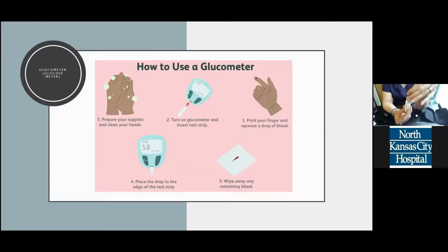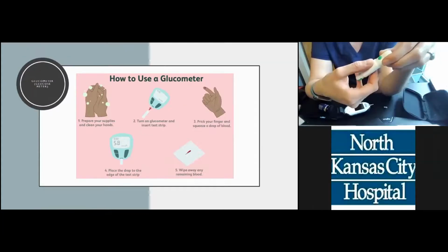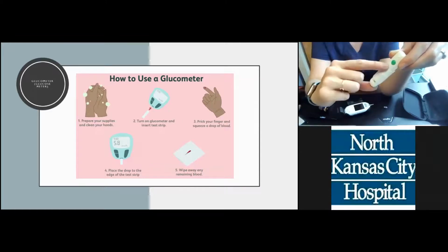So I put it in here and I'm going to twist the top just so it breaks that plastic a little loose, and then I'm going to pull it off. And I don't know if you can see this. There's a tiny little needle right there. Then I'm going to put the cap back on. And all of these have a spring, and you need to cock that spring. So this one I pull down like that. Others you may pull the bottom down, or the whole thing shifts down. This one is just on top.